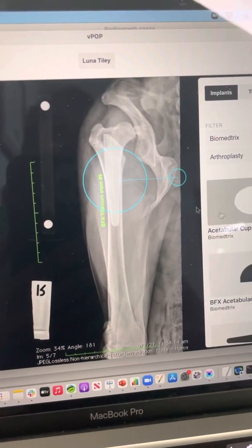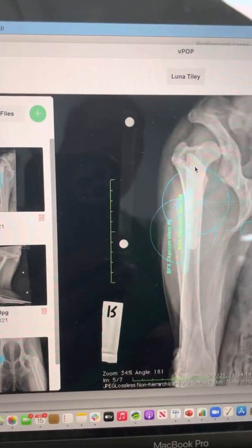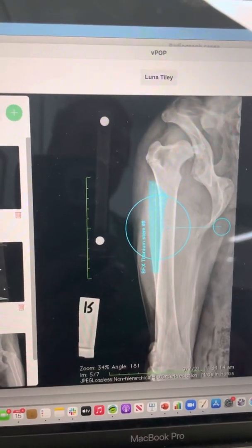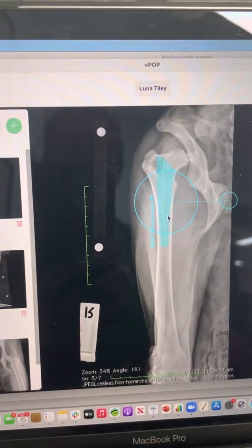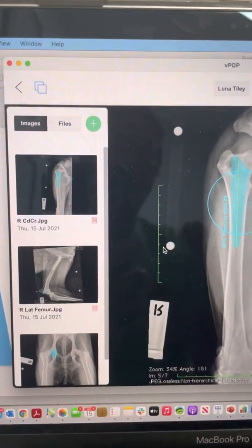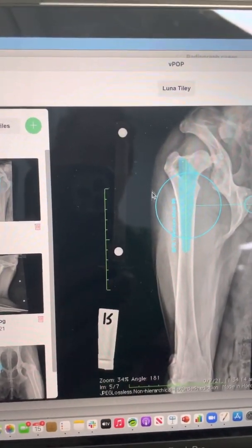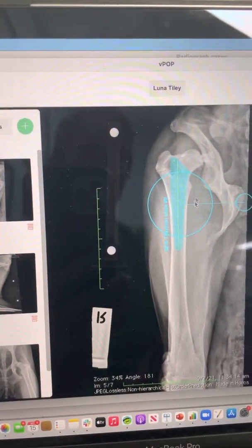Once calibrated, I can come and select my total hip replacement implant and change the sizing as needed. I'm not going to go through all the detail of hip replacement templating here — I really just wanted to show you the importance of the calibration markers. You can appreciate that if that calibration marker was at a different distance from the x-ray plate than the area of interest — in this case the femur — we're going to get an inaccuracy in the size of the implants we're going to use.